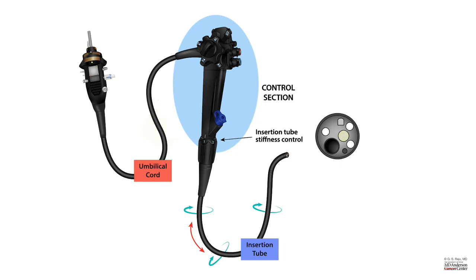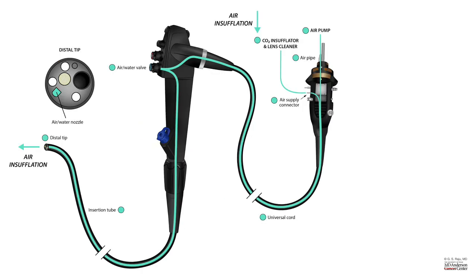So we looked at the scope, we looked at the structure, and let us look at the channels. So how does air insufflation work? As you can see, there is an air insufflation CO2 insufflation connector, and there is an air pump, and when you press on the blue button, gently occlude the button, then air or CO2 comes up, and that's the path. As you can see, umbilical cord, scope head, insertion tube, and through the air water nozzle it comes out.